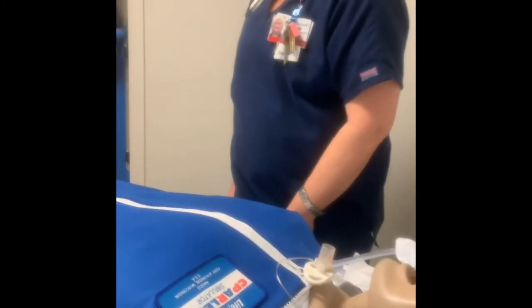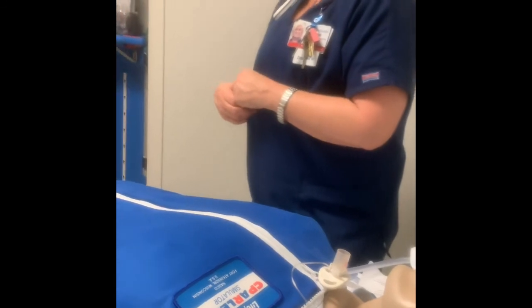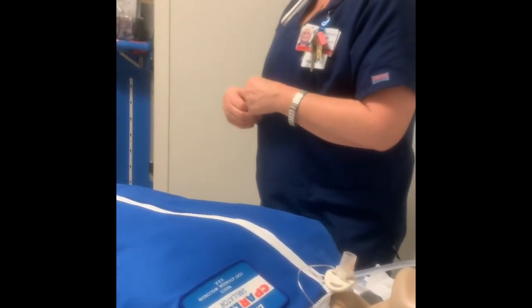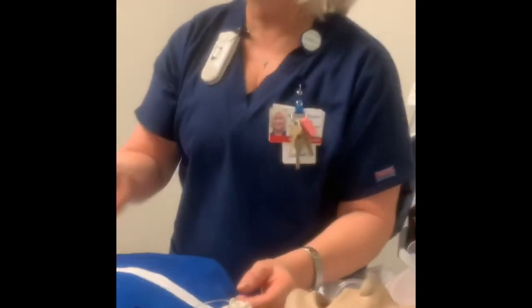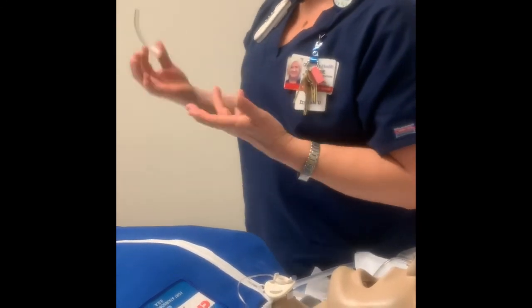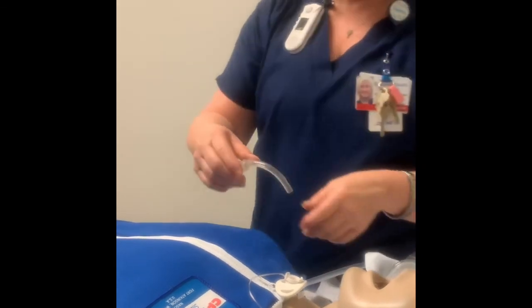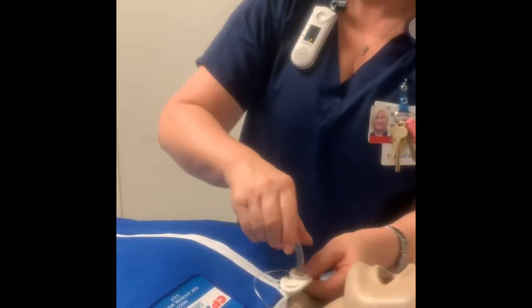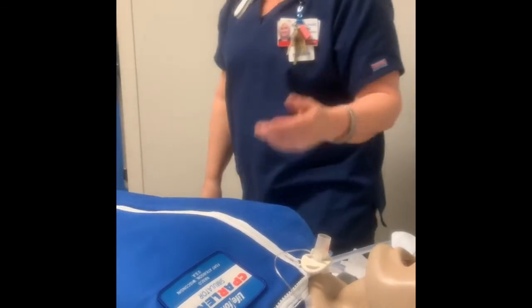Cleaning that inner cannula always got me more than the actual suction. Really? I don't know what it was, looking at it all crusty, you know. But if it's disposable, then you don't even clean it. You just take it and throw it away. Okay. And I prefer the disposable ones because I don't like cleaning them. Yeah, I just prefer to throw them away and get a new one. Exactly. And that's pretty much most trachs, but some of them you do have to clean.